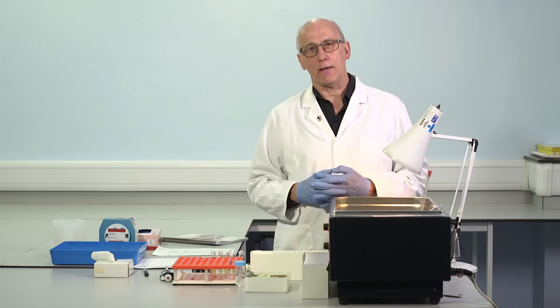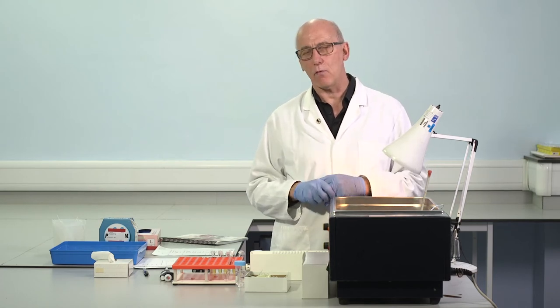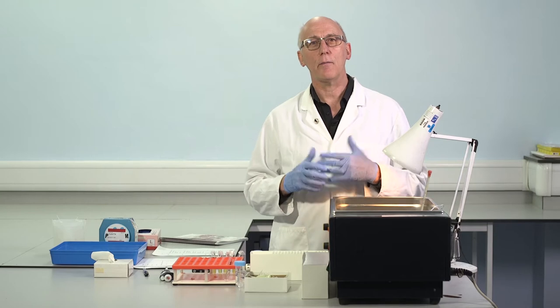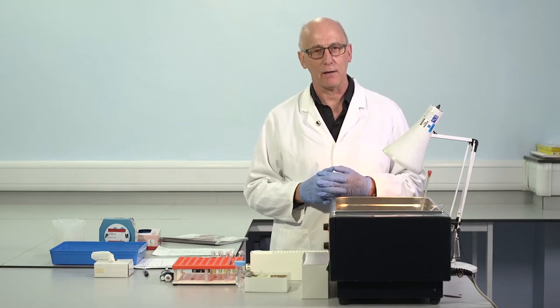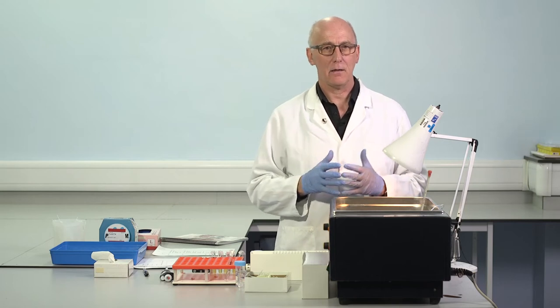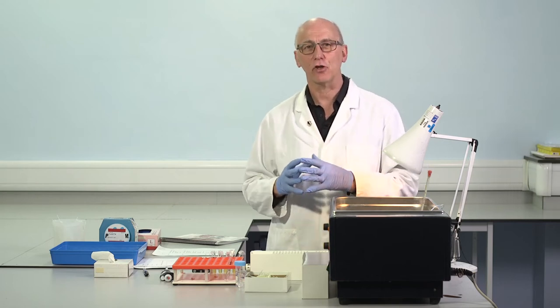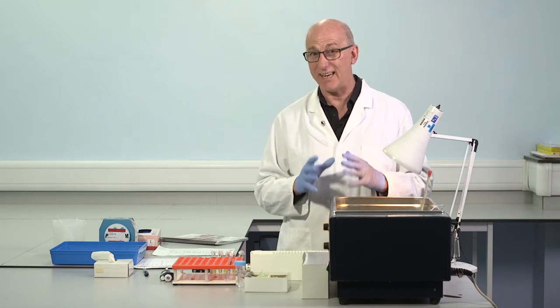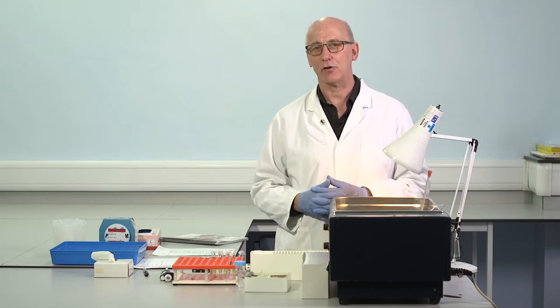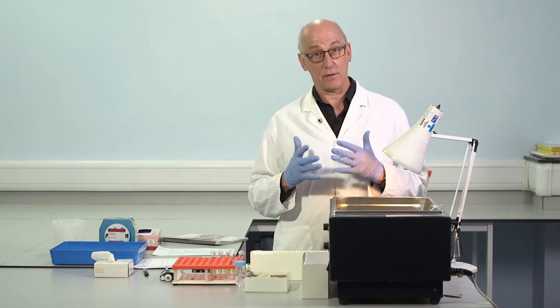How do we assign that target? Well, if we buy a commercial control, then the manufacturer will give an indication of the relevant target for their particular instrument and reagent combination. We know the results are influenced by the reagent, but in addition by the method of endpoint detection. So the manufacturer will give a target range.